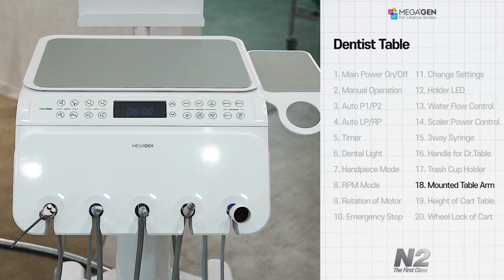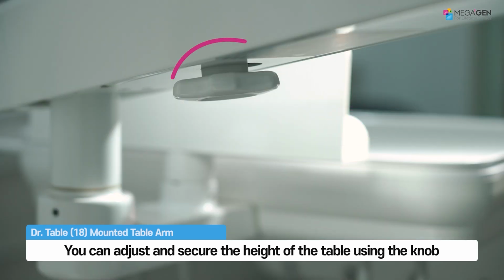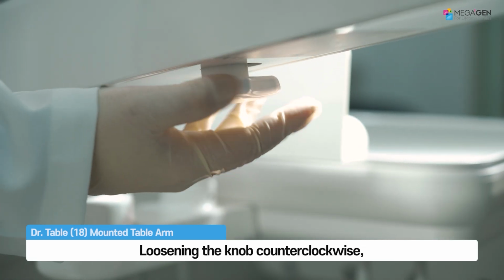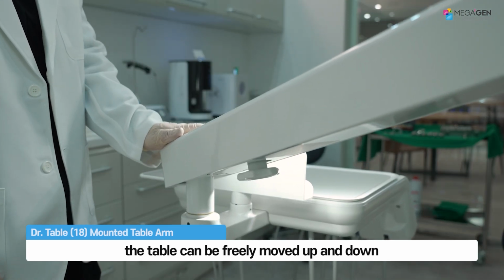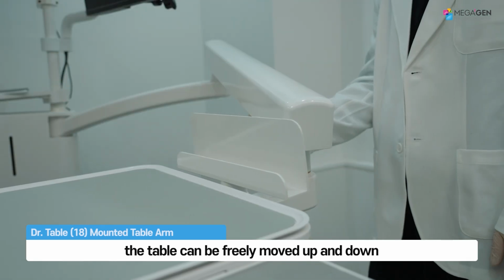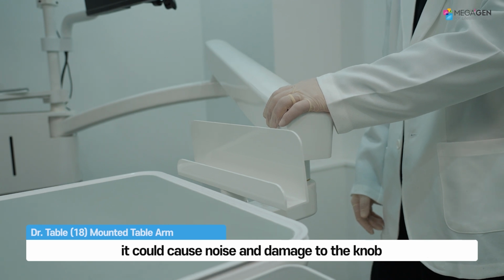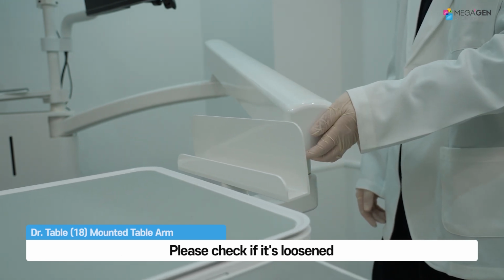Mount table arm locking knob. You can adjust and secure the height of the table using the knob located at the bottom of the mount balance arm. Loosening the knob counterclockwise, the table can be freely moved up and down. Tightening the knob clockwise, it can be fixed at the desired height. If you try to move the table up and down with the knob fixed, it could cause noise and damage to the knob. Please check if it's loosened.